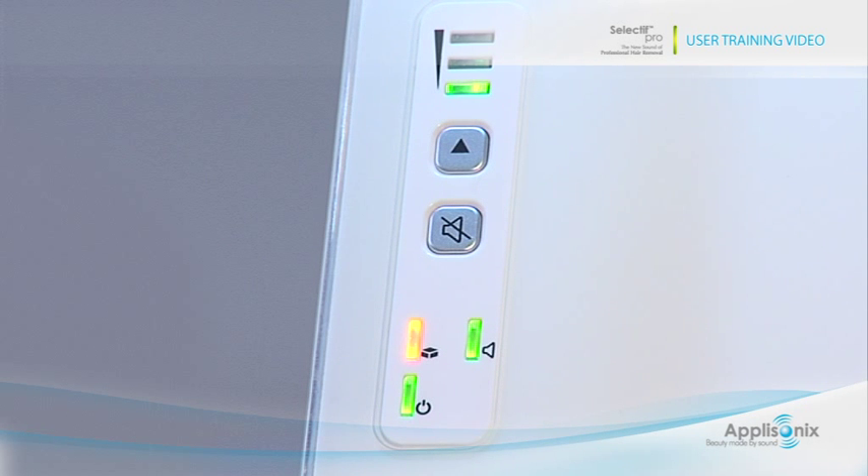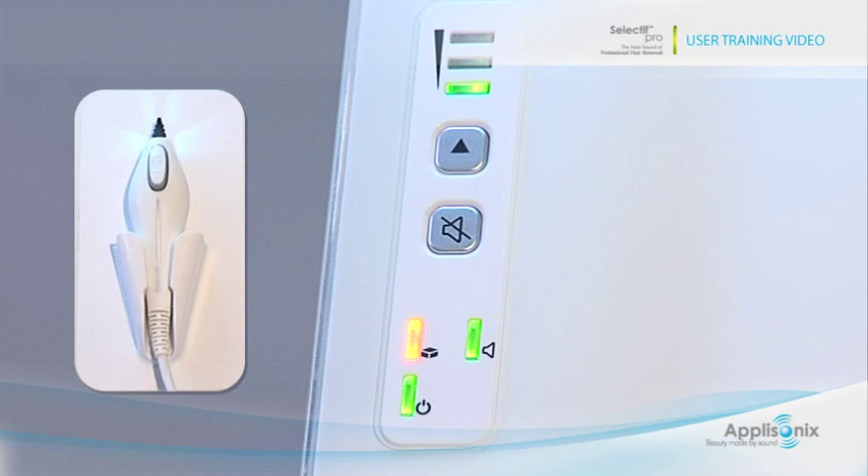The system will alert when the probe reaches 90% of its capacity — the status light will blink slowly in orange. You may continue working as before, but make sure to place an order for an additional probe. When the probe reaches 100% capacity, the status light will turn to static orange and mode A will be blinking. You will not be able to trigger any more pulses.